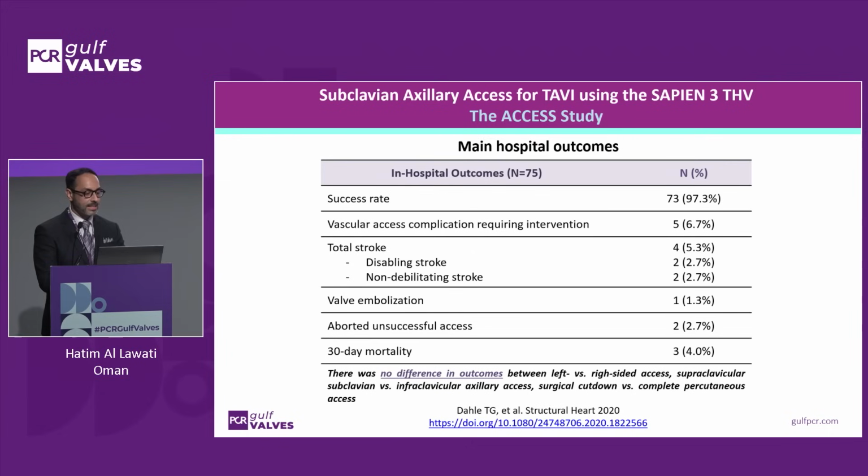This is data from the ACCESS study showing that transaxillary approach has an upwards of 97% success rate with a very low risk of vascular access site complications, strokes, and a low 30-day mortality.